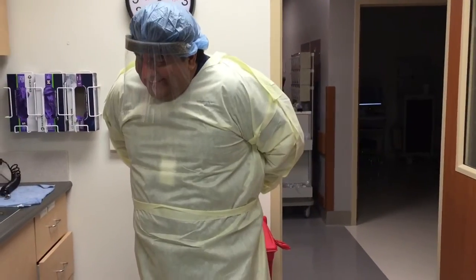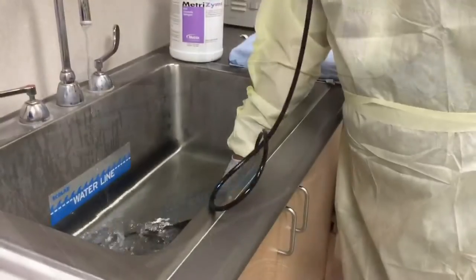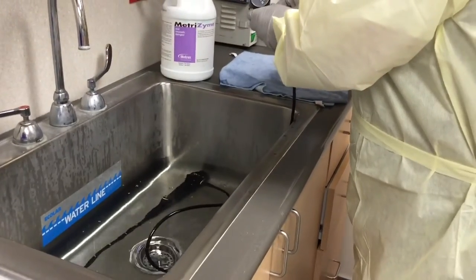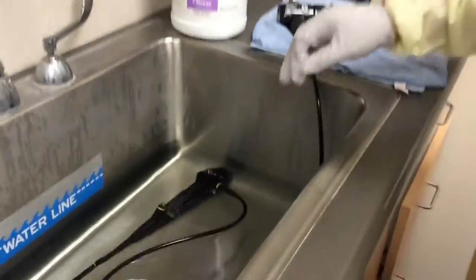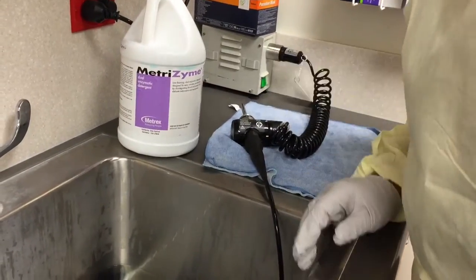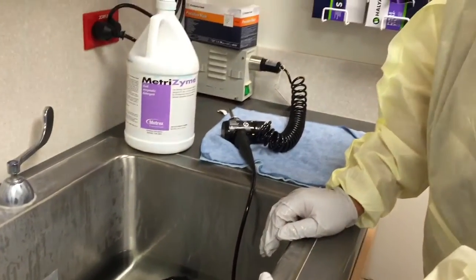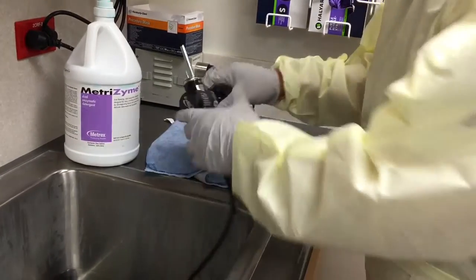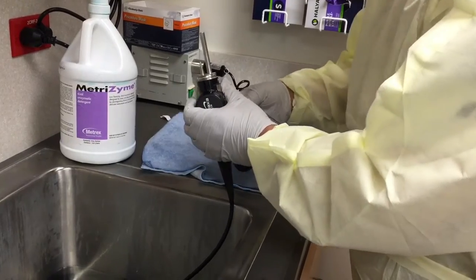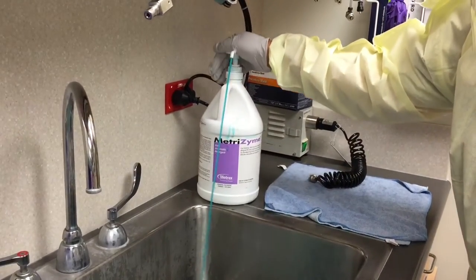Oscar is getting ready and wearing his eye protection and gown before cleaning the scope. Oscar has submerged the scope and he's gonna do the leak test. Seconds, right? Then pumping. Go. When I use 6 pumps of soap.